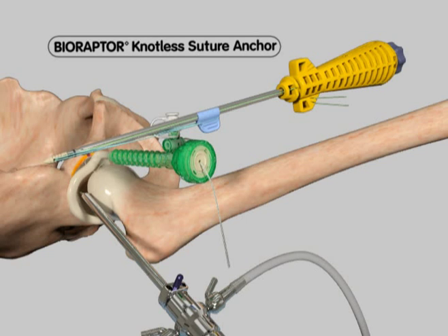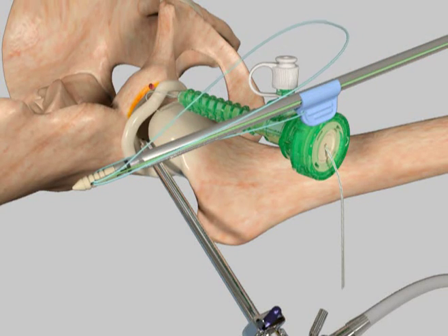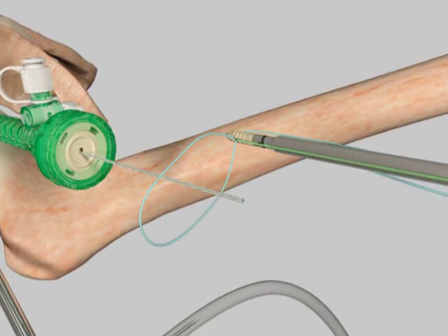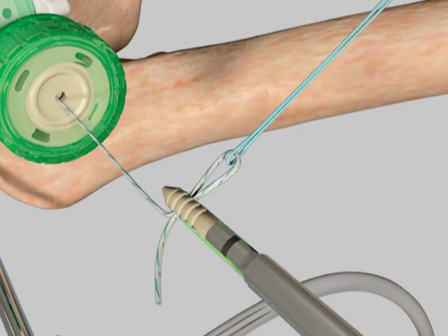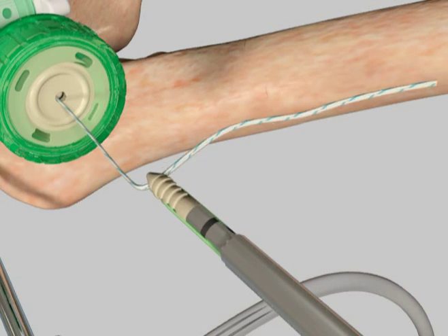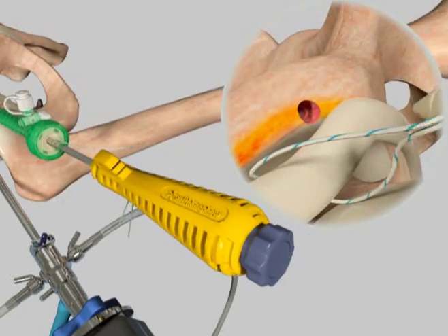While holding the anchor handle, push the suture threader tab forward to release the suture threader loop. Thread both free ends of suture through the suture threading loop, remove the suture threader tab from the shaft of the device, and pull to feed the sutures through the anchor eyelet. Advance the loaded suture anchor into the operative cannula and toward the prepared hole.